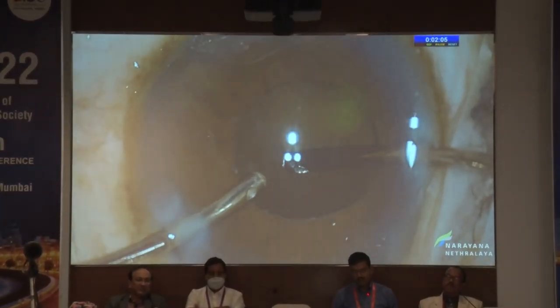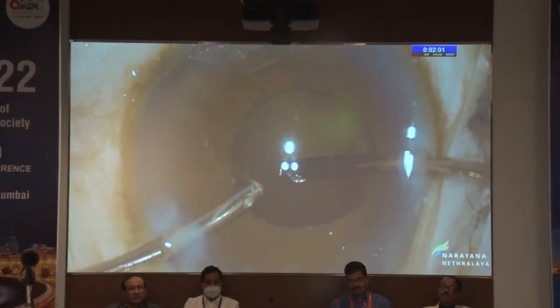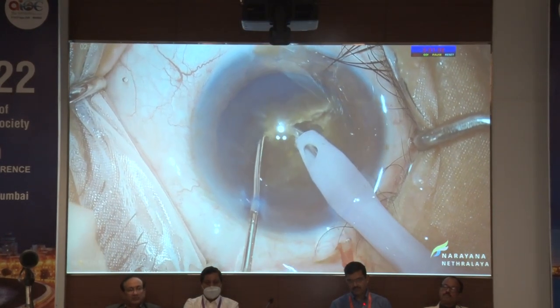This can happen only if there is no lag in the system. If what is happening in reality is exactly what you see on the screen, then only the reflex is good and you prevent the complication.